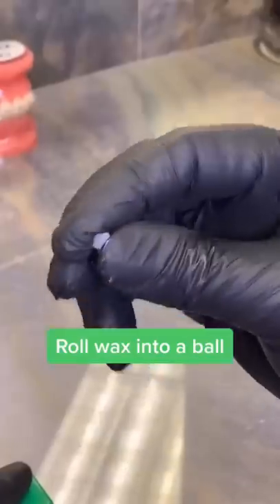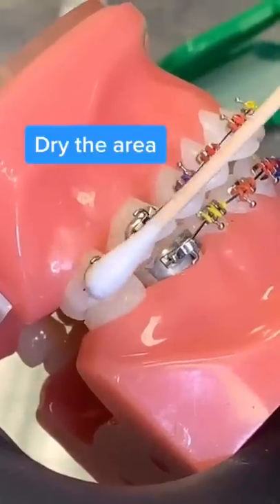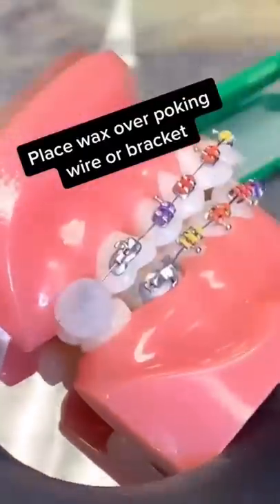How to use orthodontic wax: roll wax into a ball, dry the area, and place wax over a poking wire or bracket.